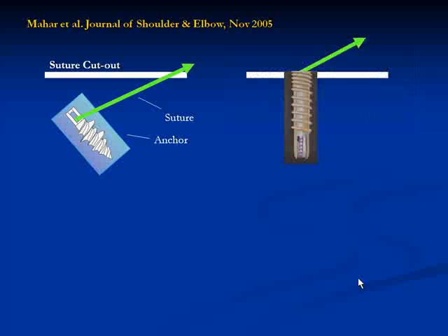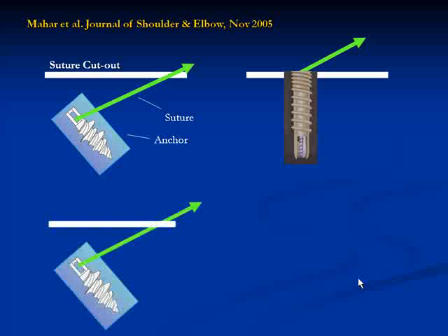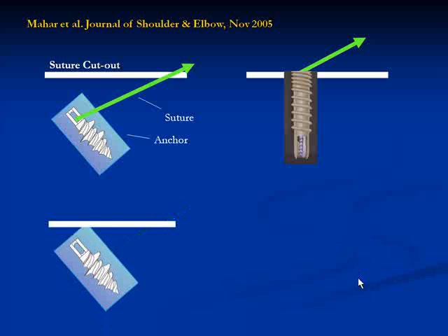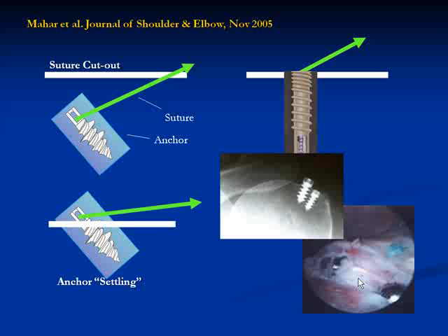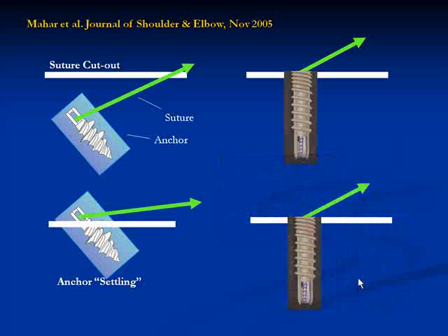With an anchor of this design, because it's inserted just to the cortical surface, the strength of the implant prevents that cutting out from occurring. And furthermore, another issue is anchor migration. When the anchor is placed in the cancellous bone, if the bone is soft, it will migrate with tension up to the cortex, and then it will usually stop at the cortex. But the problem is the head can become proud, and of course gapping can occur again. So a fully threaded anchor like this will tend to resist that migration.